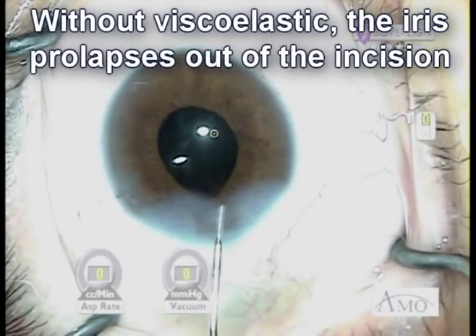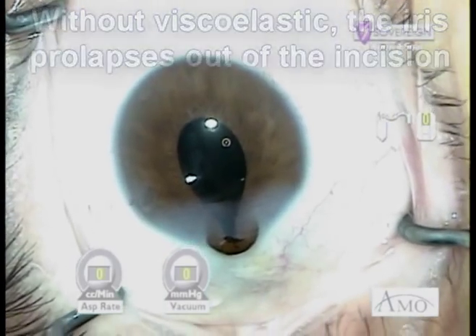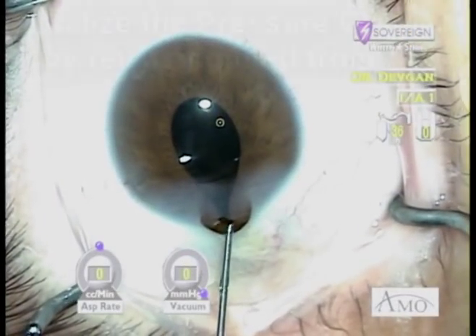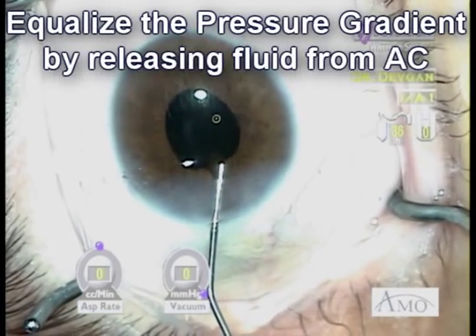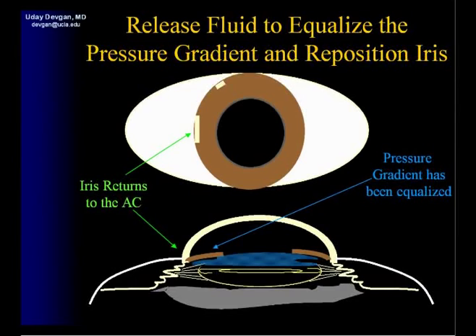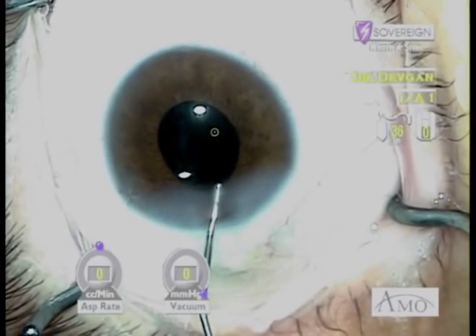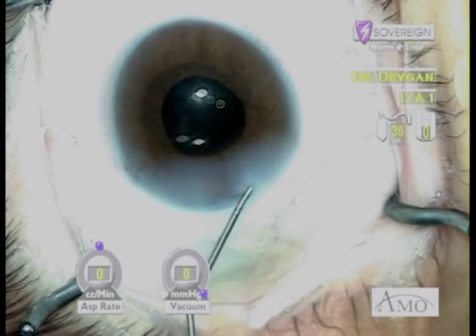At the end of the case we finally see the iris prolapse. This happens frequently in these cases. It's due to a pressure gradient — pressure behind the iris is causing it to come out. An easy way to fix this is just to release the fluid, flatten the AC, release the trapped fluid — the pressure is equalized and the iris goes back in the eye. The pressure gradient needs to be equalized. Injecting more viscoelastic on top of the iris would equalize it by raising the pressure on both sides of the iris, but here I'd rather lower the pressure.